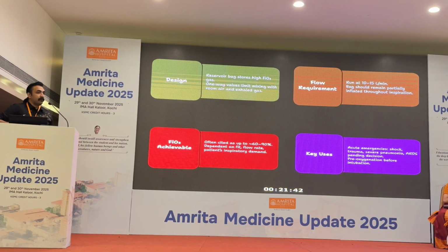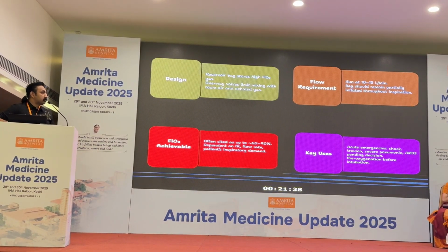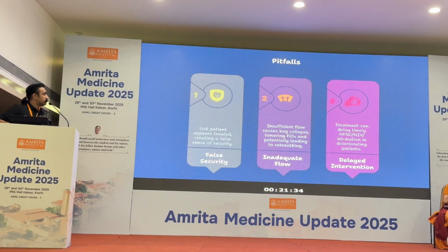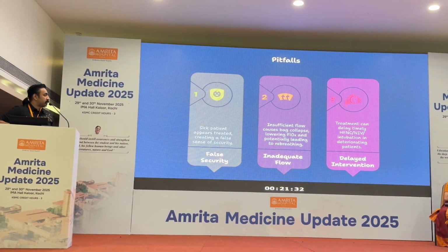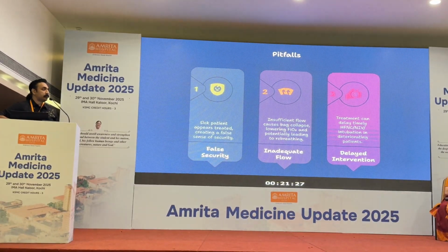So here again, very high FiO2, you can reach up to close to 90%, and the key uses are very much in emergency situations, as a starting point itself. Pitfalls, again: this gives a false security, inadequate flow, and delayed intervention at times.